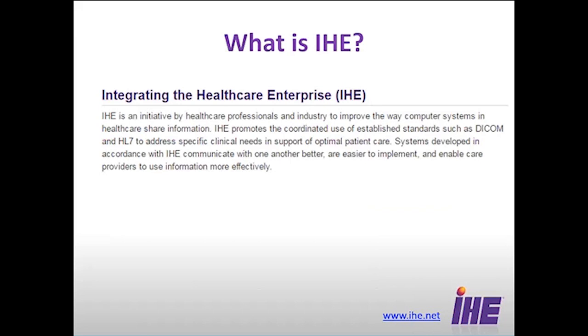What IHE does is not write brand new standards, but use established standards, and I think of it as a standards refinement to improve the interoperability. The standards, DICOM and HL7, are the two we work with most of the time.